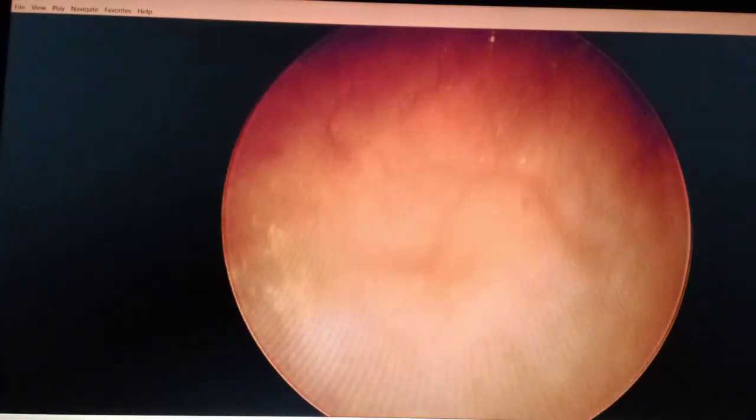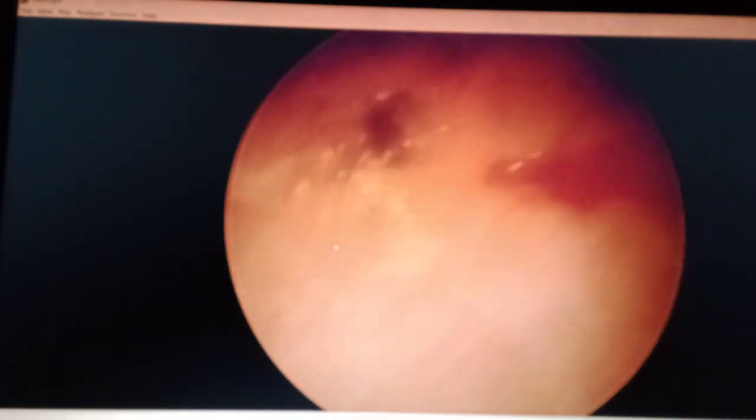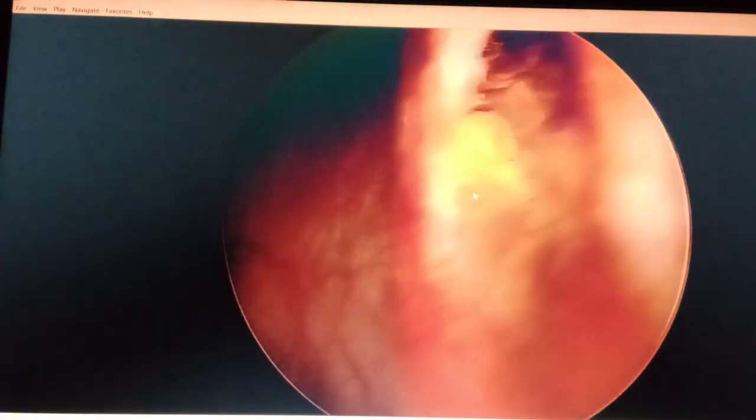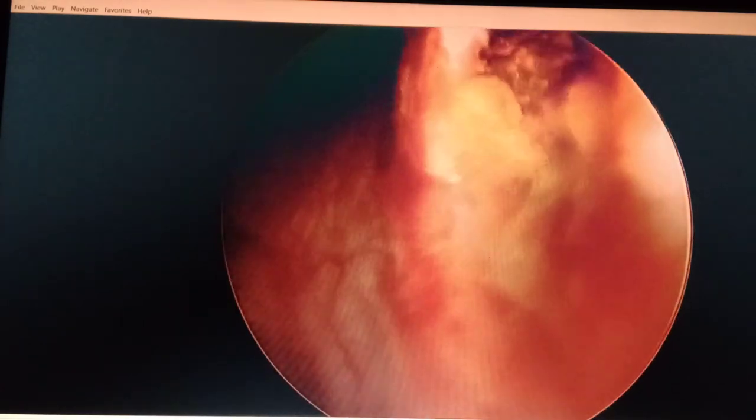Hydrodissection is a very important tool in management of these types of patients. You can again see a small amount of stone is coming out. Try to just mechanically dislodge it. Now here you can see the fragments of stones we have cleared so far from this ureter-vesicle junction opening. Cystoscopy has already been done; we are just focusing on the left ureter-vesicle opening.